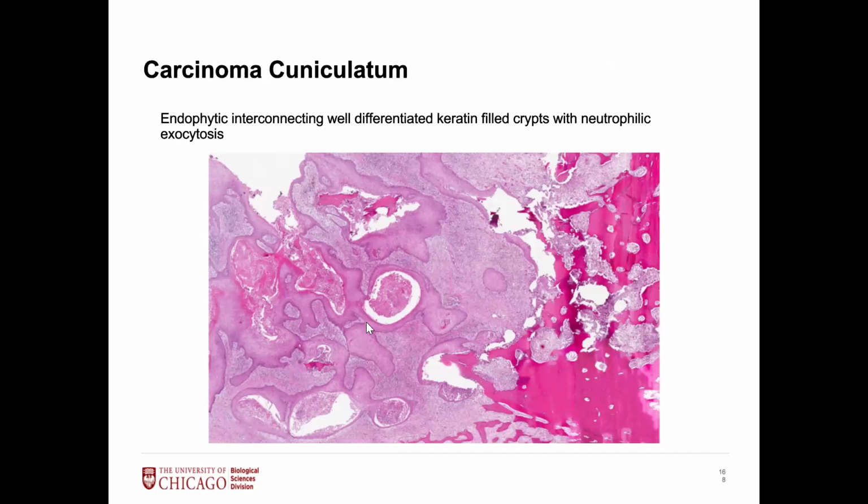But if you get a biopsy of this, let's say just this one cystic dilated structure, this is so well differentiated that this has been misdiagnosed as a cyst, or this has been misdiagnosed as just reactive squamous epithelium. This has been misdiagnosed on frozen sections, this has been diagnosed on margins. So you have to think about, does that epithelium belong in that particular location? How far deep are you? Is there any atypia? How big is this mass? This is a destructive process.